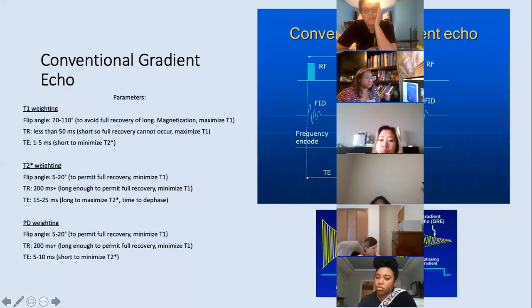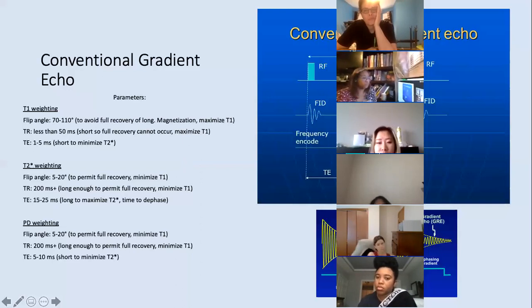You're heating up the patient by about 1 degree Celsius in core temperature when you go to first level. So that could potentially have ramifications on burns and heating and things like that. So it is an option, but if you have another option to reduce your SAR, I would choose that.